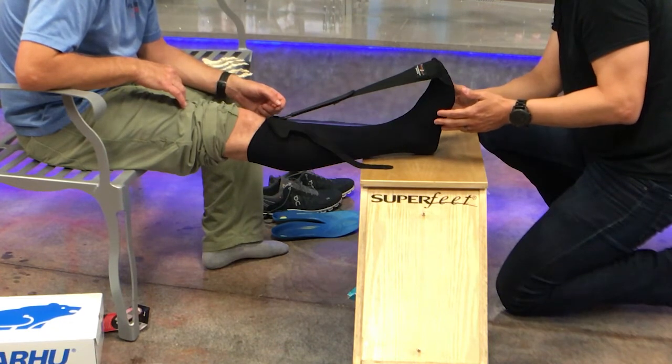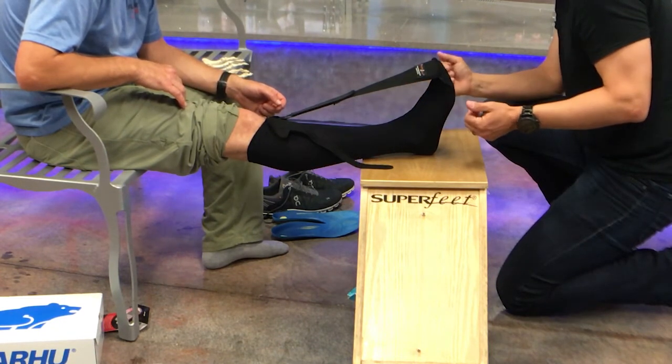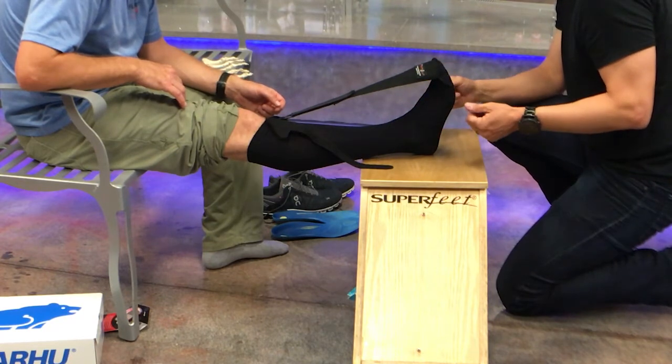Wear it in the evening for a few hours when you're watching TV or working on the computer. And then when you go to bed, wear it for six hours or so.